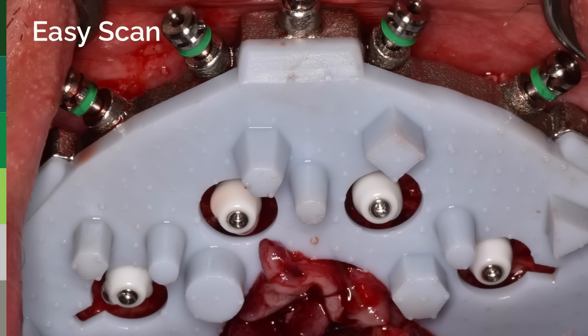It has openings for either healing collars or scan bodies, or even flags from photogrammetry scanners. Anything that you protrude through there that can be scanned and then turned into a file, which Rowe Dental Laboratory is very adept at. Has a massive library of all these healing collars and scan bodies used in America.